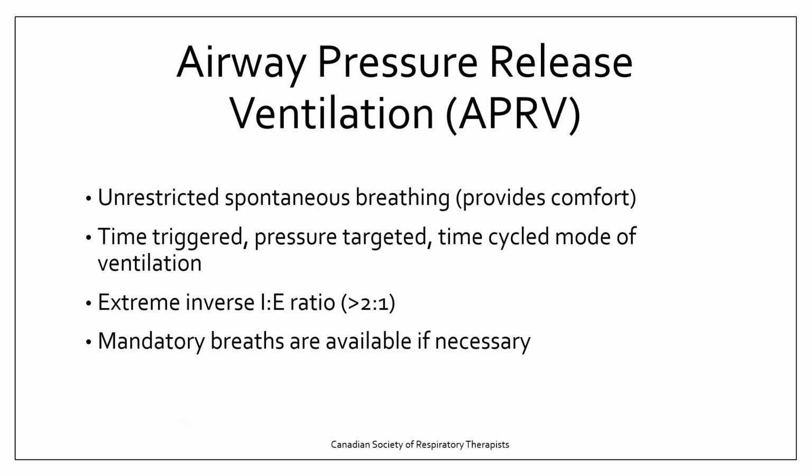And then lastly, we'll talk a little about airway pressure release ventilation, so APRV. Here, it's honestly sort of an extreme inverse ratio ventilation. So now we're spending more time in inspiration than we are in expiration. And it does allow unrestricted spontaneous breathing at 2 different levels of pressure.